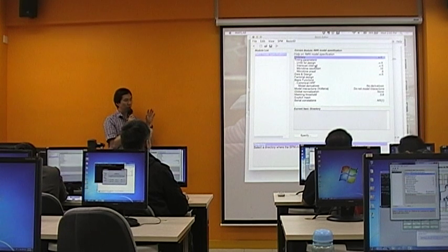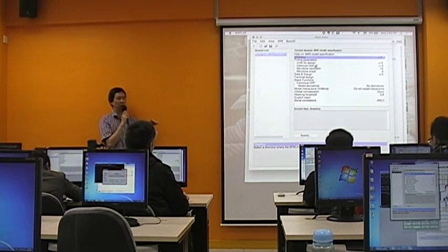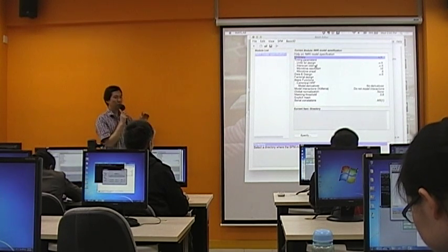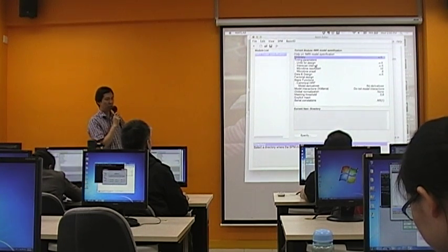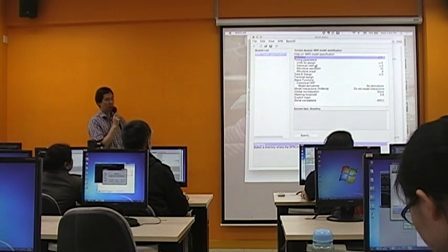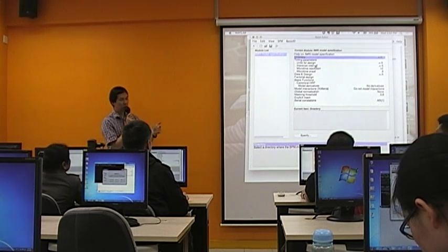Along the same line, you also should have different folders for the first level model. First of all, for each subject you need a space to store the results of the general linear model you are going to run. Plus, you might not only examine one single model.